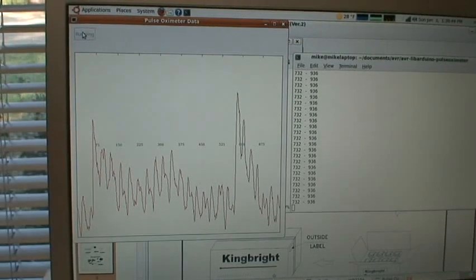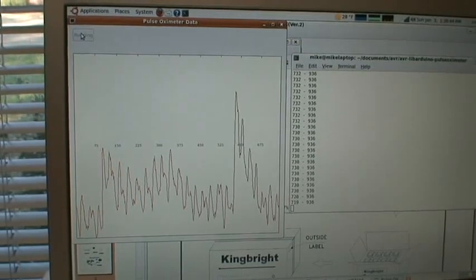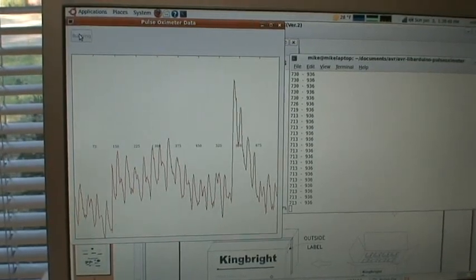Have you ever been to the doctor and they put the little clip on the end of your finger, and from that they can tell what your heart rate is and your oxygen saturation? Well I have, and so I decided to build my own in order to figure out how it works.